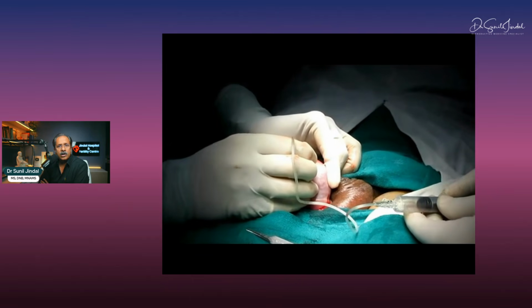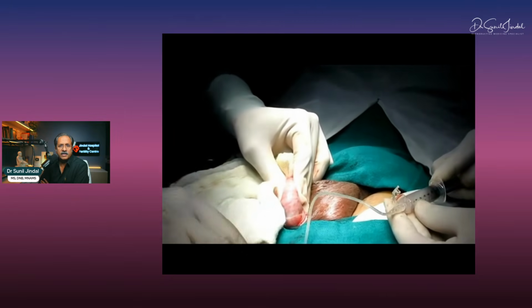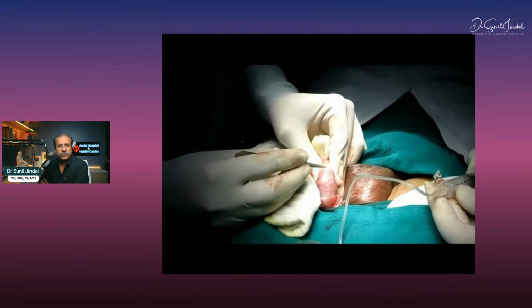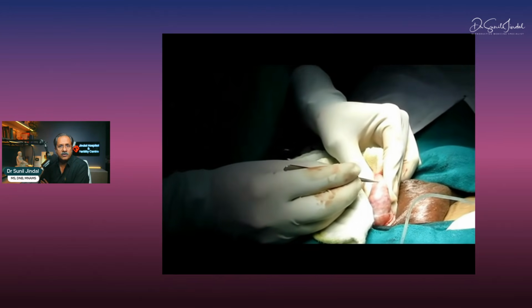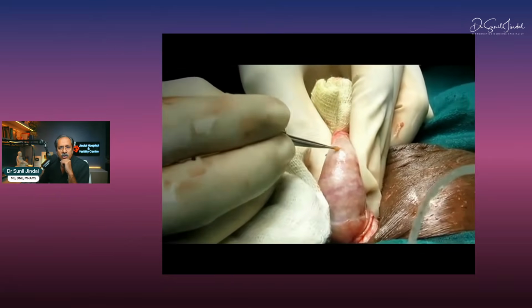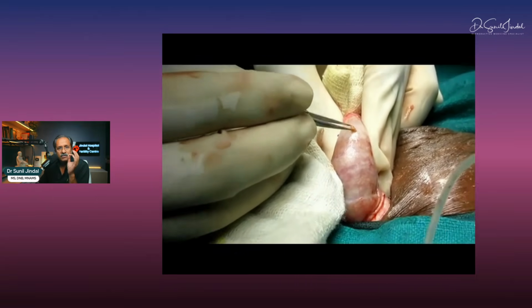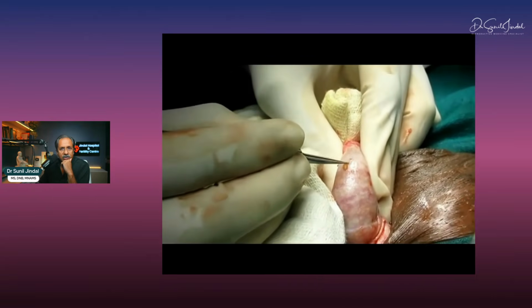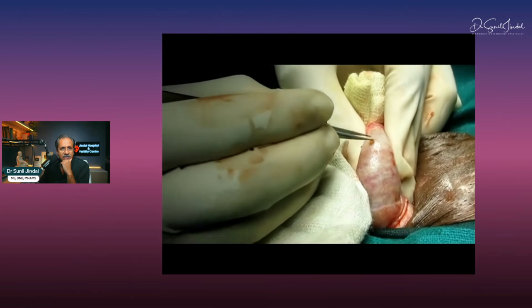We are going to now give pressure, pull the needle out, we get some tissue, but some tubules also come out. Now, these are the tubules which we normally are going to hold, and with a microforceps, go on taking out this tubule till the time we get some tissue. Taking out this tissue becomes extremely helpful for us.